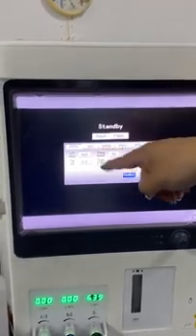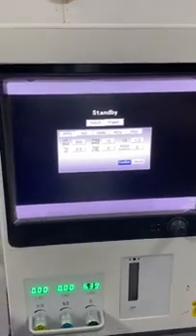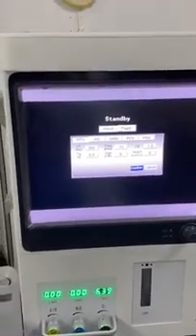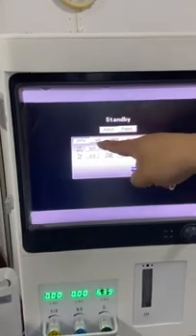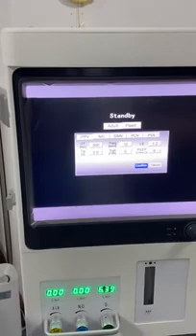It means it can change automatically. For example, a patient is breathing spontaneously, but suddenly stops breathing on their own. Then the machine will automatically detect this and change to control. So the machine will automatically give gas to the patient to keep them safe.